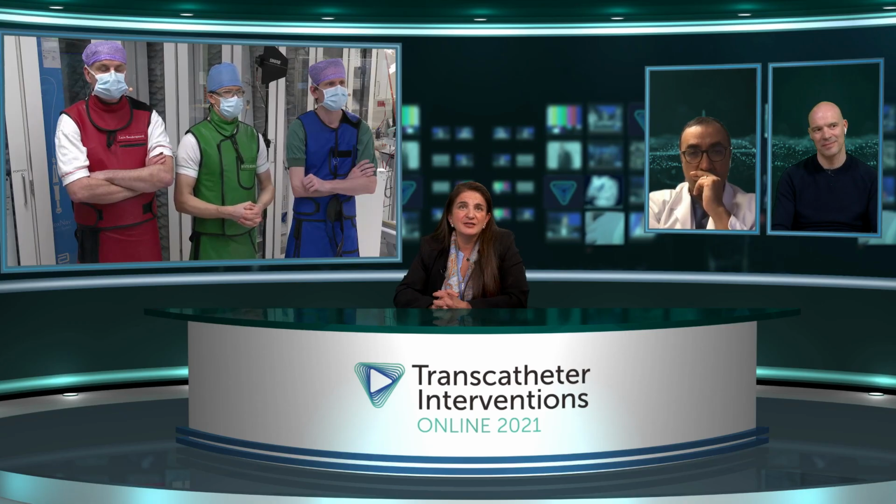Azim, last thoughts on this before we go to Ole and Niels, because they did such a beautiful job with Lars. Azim? No, just great case. For me, it's the first time I see an Omega. In the US, we still only have Watchman, so it's nice to be able to see a new device.